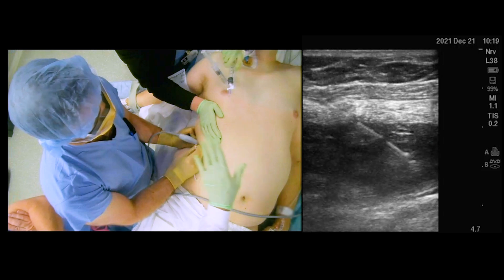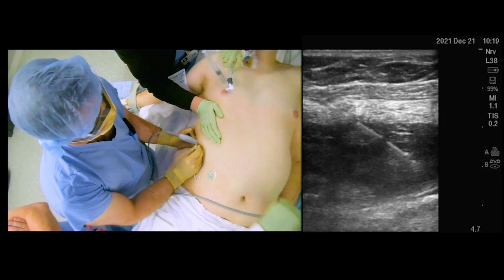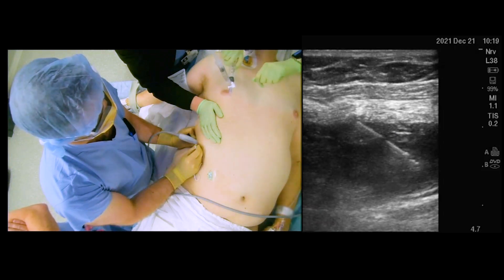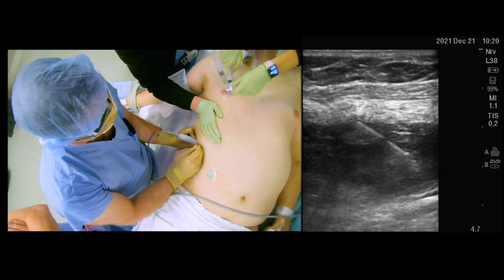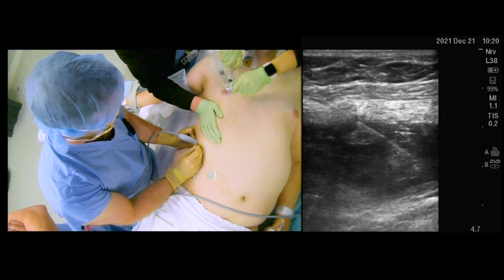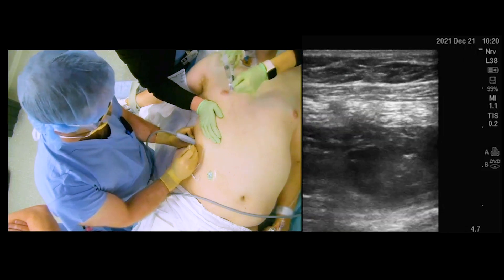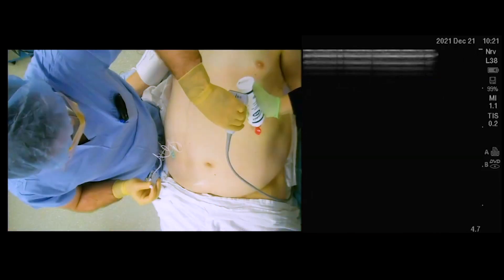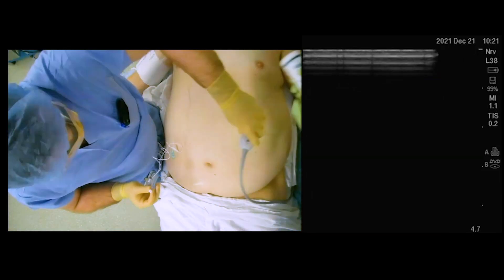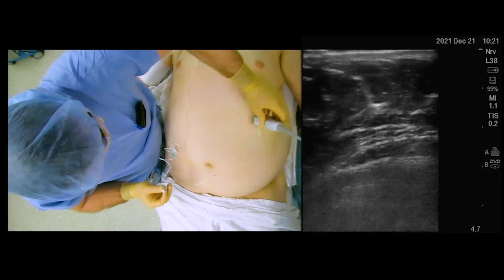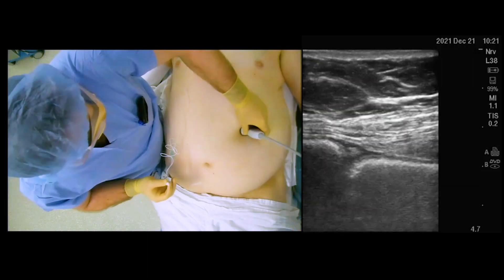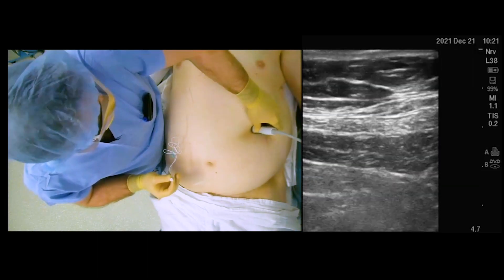The administration of local anesthetic can be seen spreading in the fascial plane beyond the edges of the ultrasound screen. This was then repeated on the contralateral side.